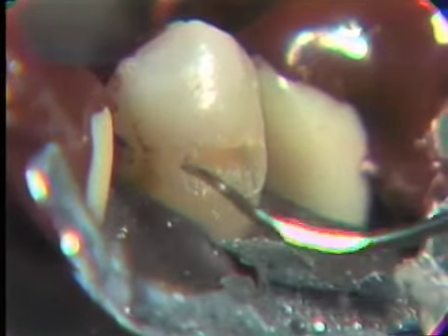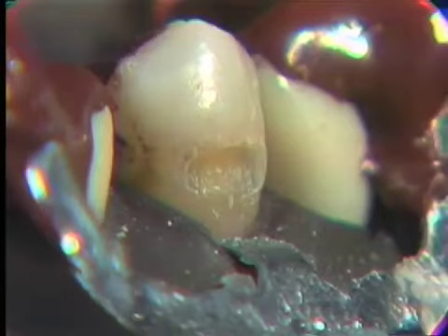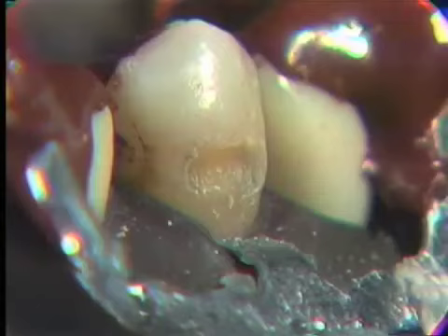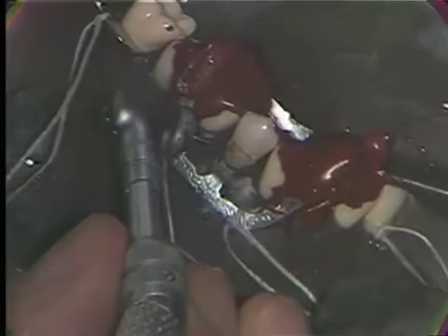We can observe by using these lower speeds the exact margin that we're cutting. We shut our water off, and now we're down with our low speed contra-angle, and we are doing the final extension. And again, we keep our burr tipped in the direction that will impart a taper to that wall.